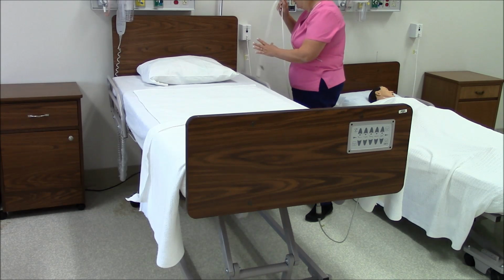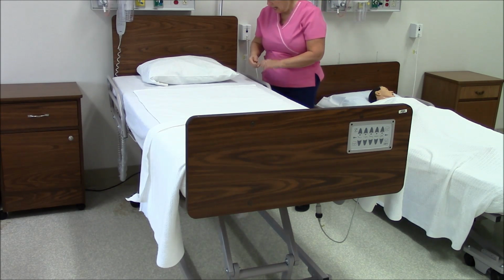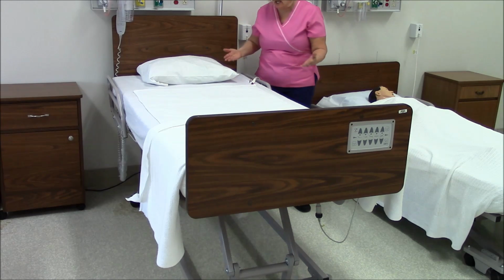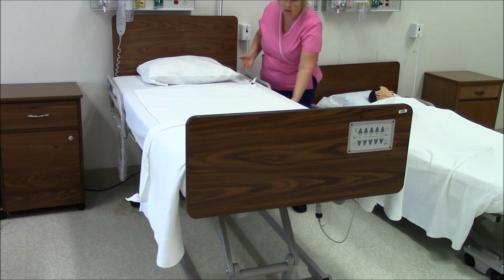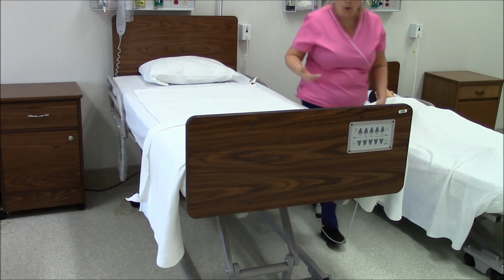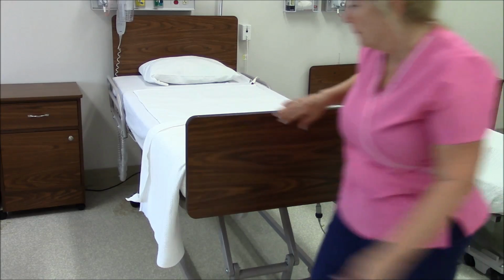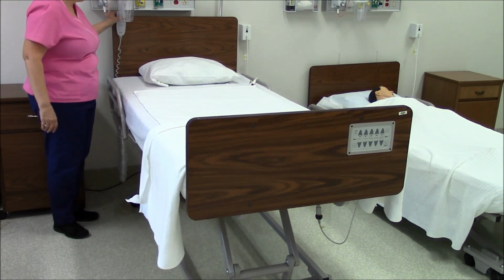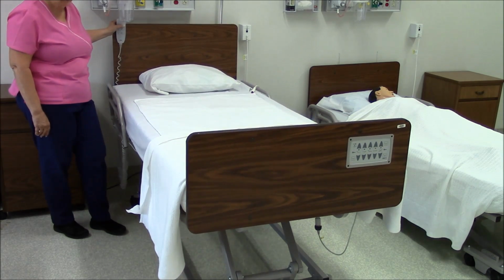I have the call light. I will pin it to the bed. And there is a nice inviting bed for your patient or resident who is coming. I will lower the bed. We always need to remember to keep the bed in low position.